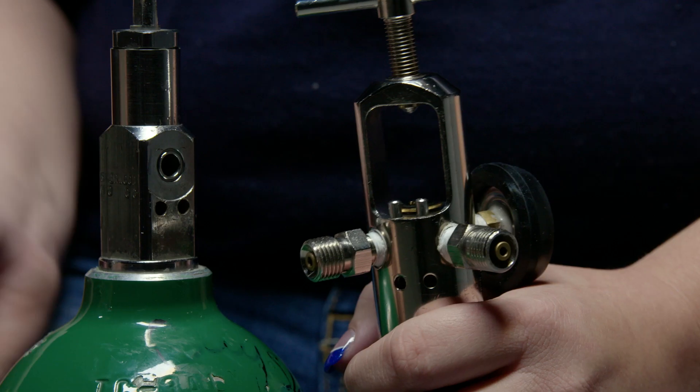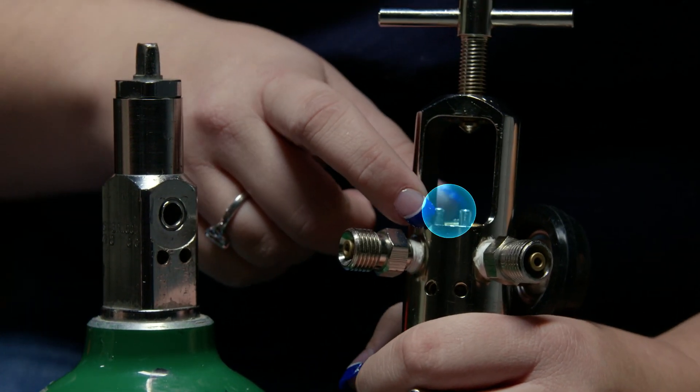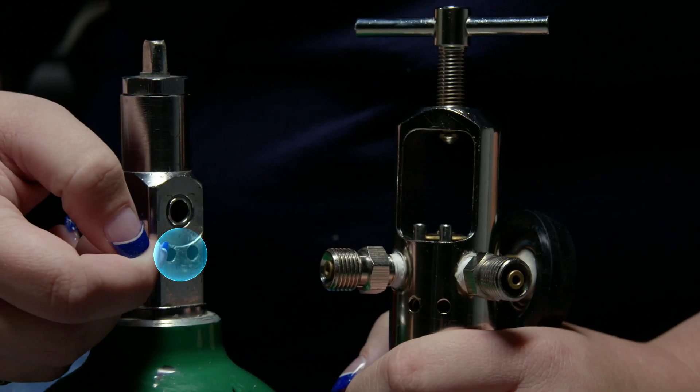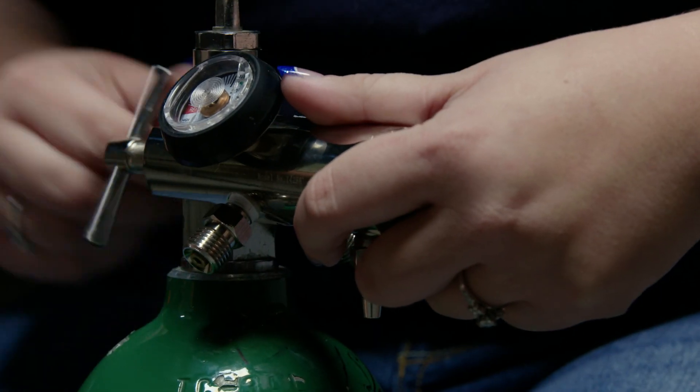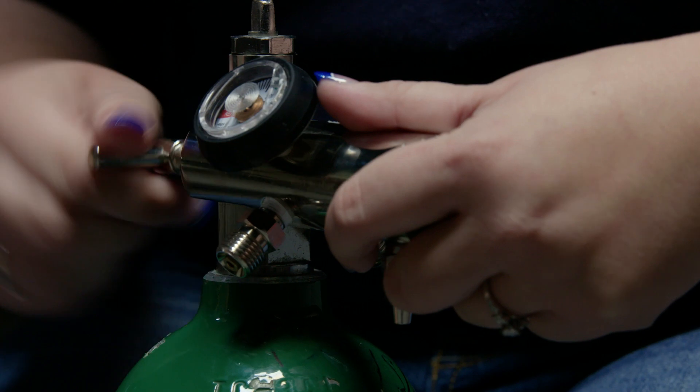I'm going to take my regulator. I will take the two prongs, make sure they line up with both of the holes, insert the prongs into the holes, and then tighten down the regulator.